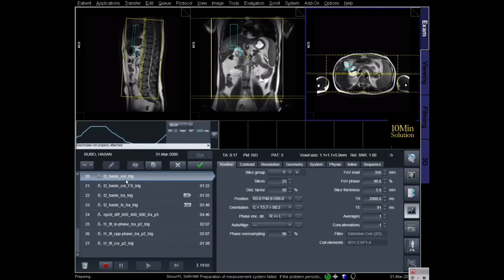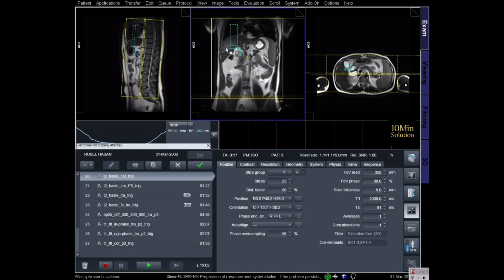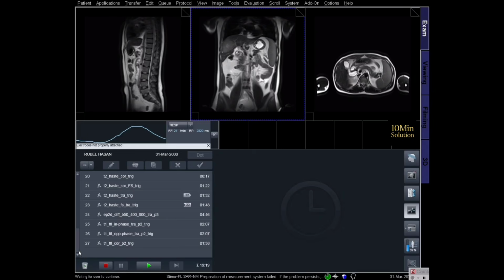Coronal images. So coronal images planning will be on the sagittal and axial images. Now I nicely set up the planning following the anatomy and physiology, and showing here the parameters. Okay, and look at the pathology. Okay, now everything is fine. Now apply.